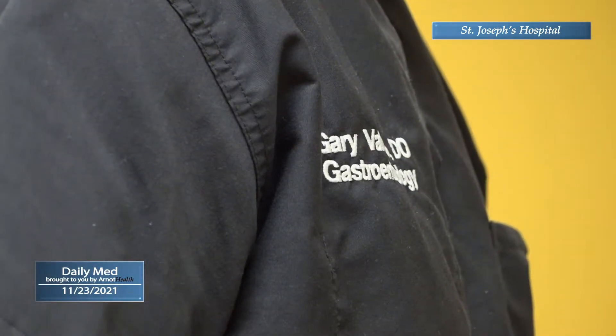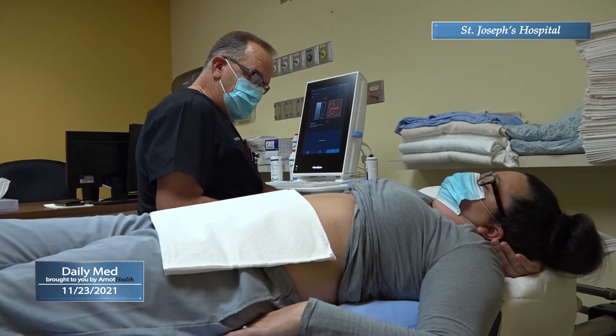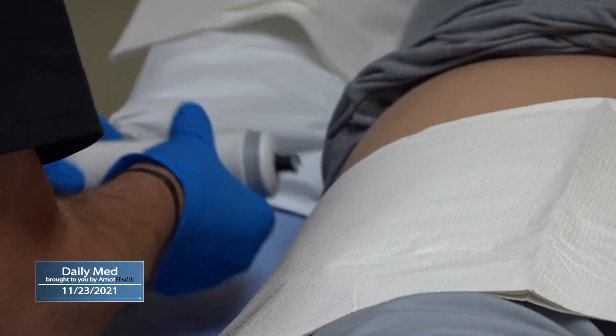If you're at risk for liver damage, health experts recommend being proactive, catching any issues early on, and addressing the problem. In one machine at Arnett Health, FibroScan can give doctors some insight on your liver health.